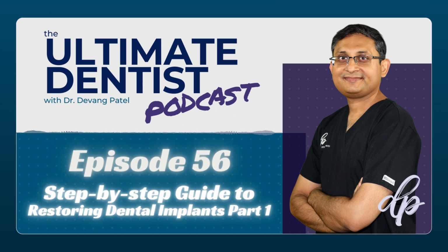Usually, with regards to pain, a tooth becomes painful and you can feel the pain, whereas many times with implants patients don't feel pain. The bone gradually erodes, and the patient will generally come and say my implant is loose, or it comes out of the mouth, or you see pus and everything, and the patient is still not in pain. So most of the time I see patients not in pain, of course if the infection is acute, then they can get pain.